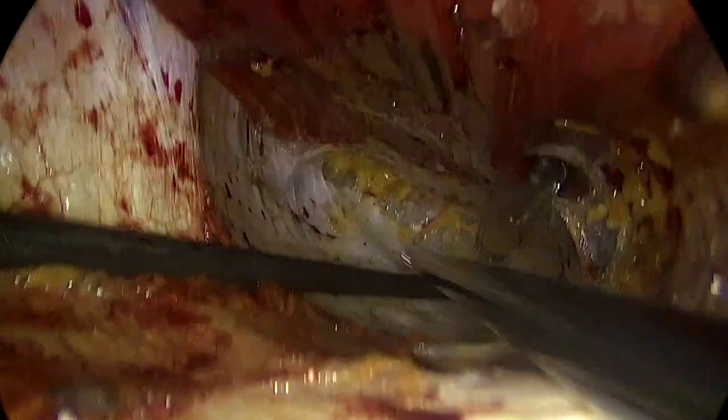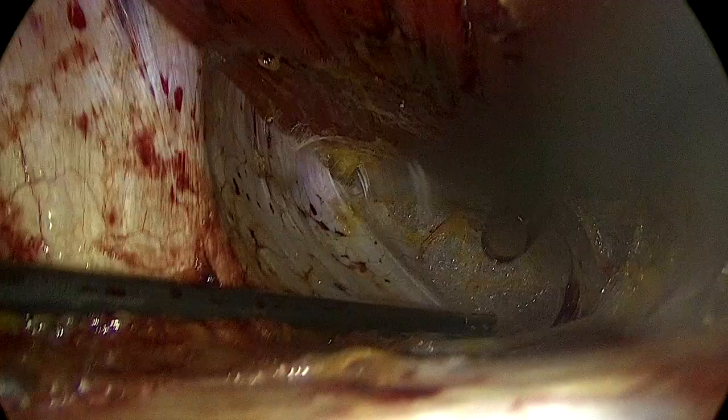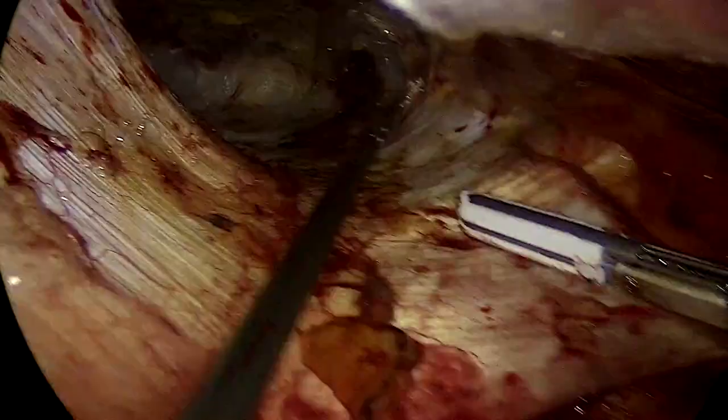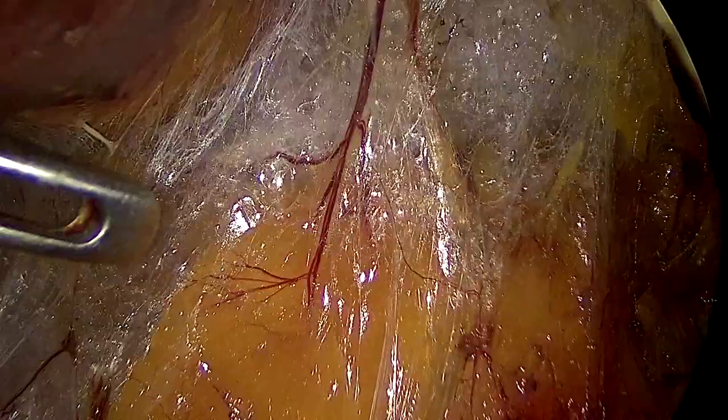Once you develop the left retrorectus space, you can see how my assistant and I work to get access into that area. The assistant is of the essence in order for you to have a very good view. You're going to go as high as you can, making sure you're at least above the umbilical scar, so that when you do your crossover, you know you're on top of the liver round ligament.